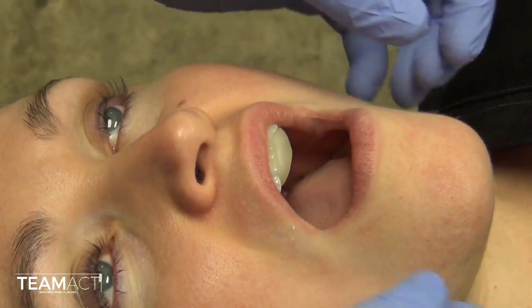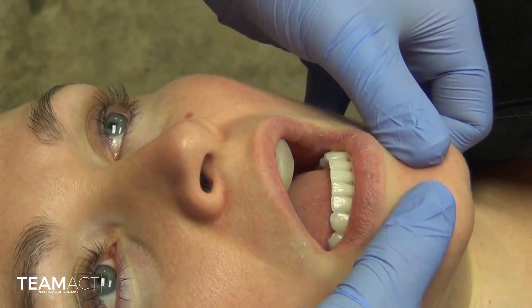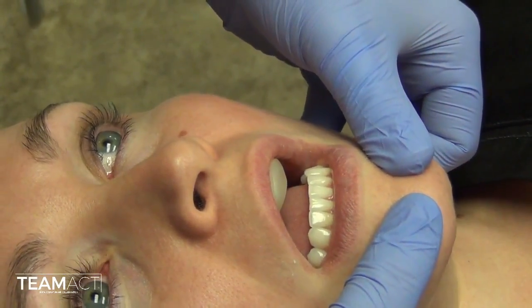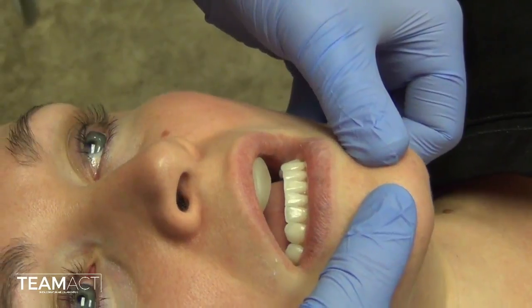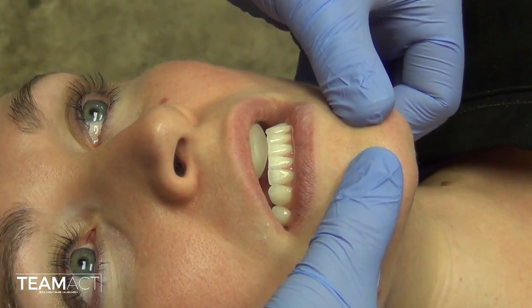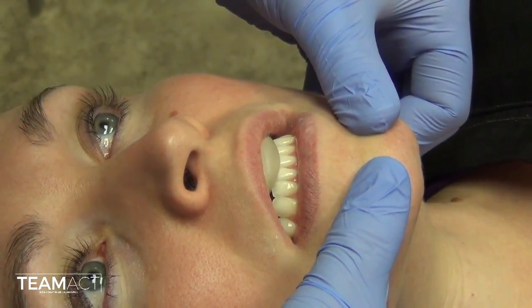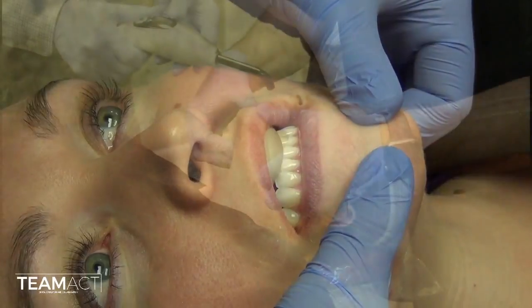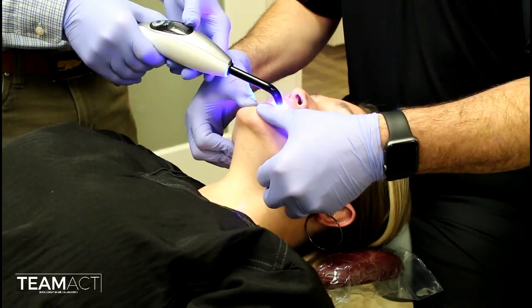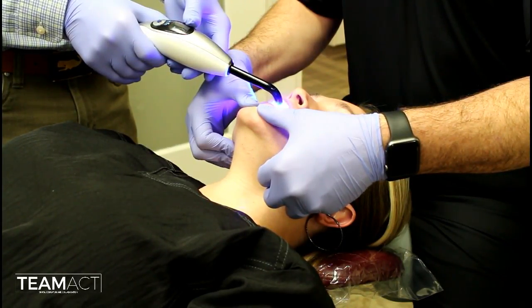Again, I will place my hands where I have had them before with the thumbs on the chin and the fingers on the posterior angle of the mandible, applying light downward pressure on the chin and light upward pressure on the inferior border of the mandible. I will have her close until she is roughly a millimeter and a half to two millimeters apart, then have my assistant cure that triad piece until it is set.